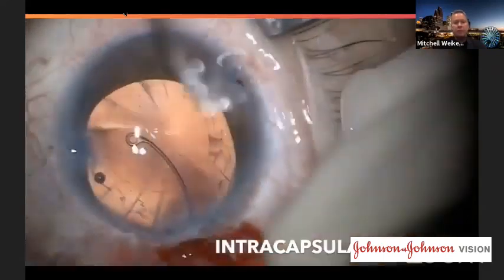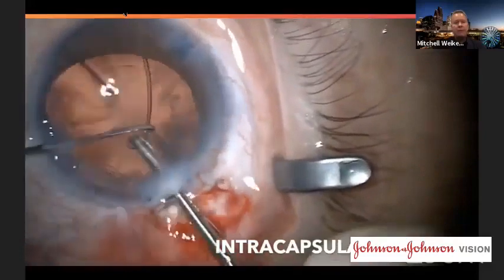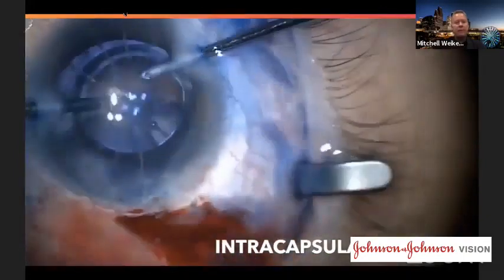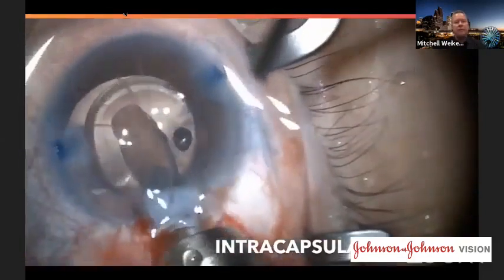So you can see we have a 5 to 6 millimeter rhexis. We're dialing in the CTR here. We just do this manually. We could use an injector as well. So we're restaining the capsule so we can better visualize it when we insert the implant. We're removing that with viscoelastic. Refill with more viscoelastic. The more viscoelastic, the better.